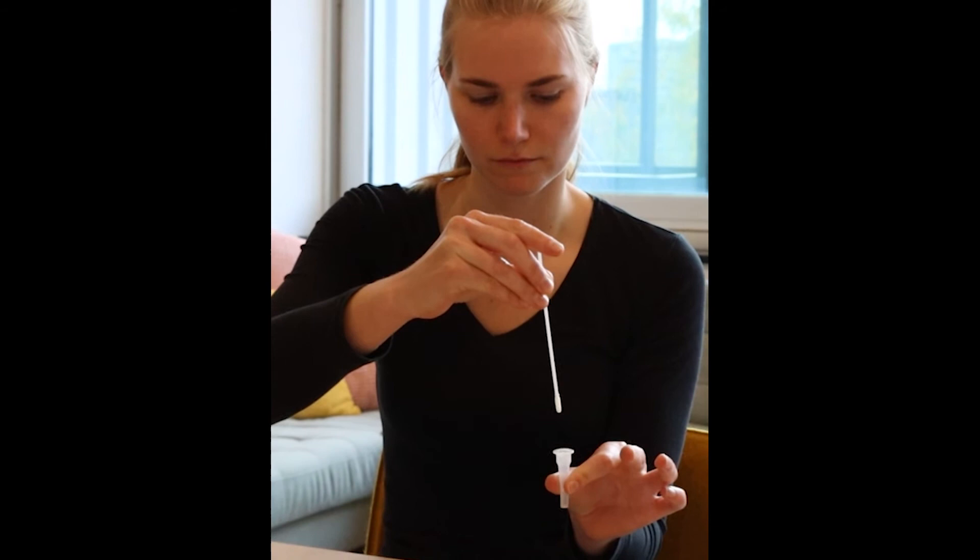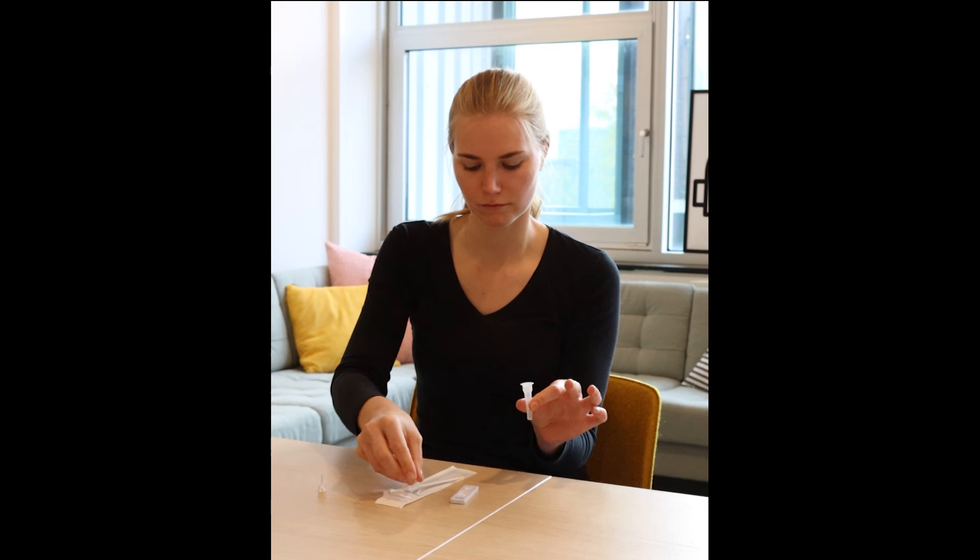Dispose of the swab. You can pull it back into its packaging for now. Press the nozzle cap tightly onto the tube to avoid any leaks.